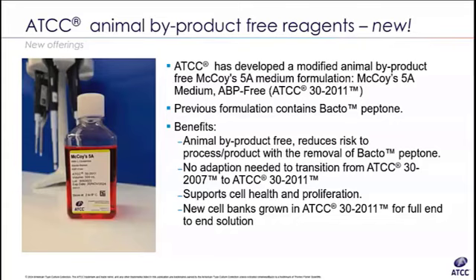All right, great. Now, this is a trick question someone wanted to throw at you. If I still have to supplement with fetal bovine serum, what's the benefit of the animal byproduct-free McCoy's? Yeah, that's a really good question. So the benefit is that you're still reducing the overall risk of introducing adventitious agents.